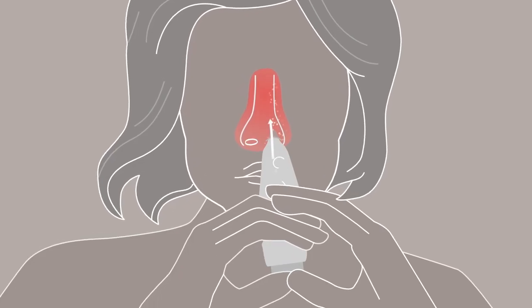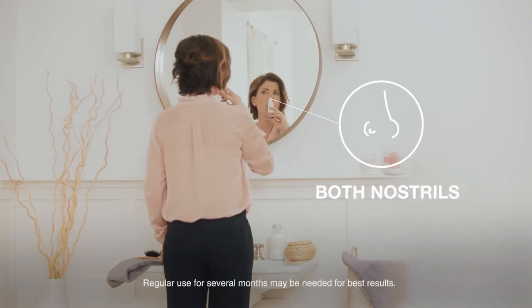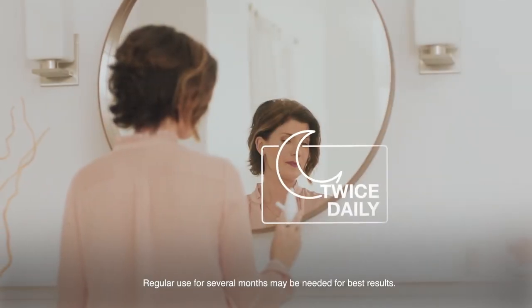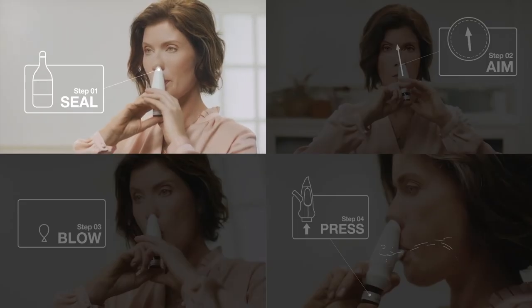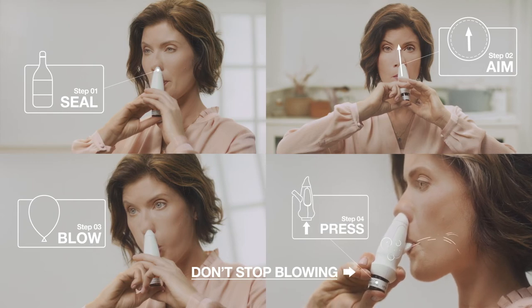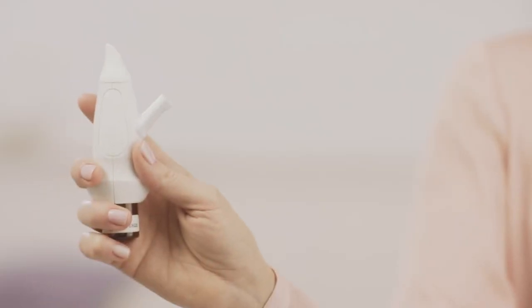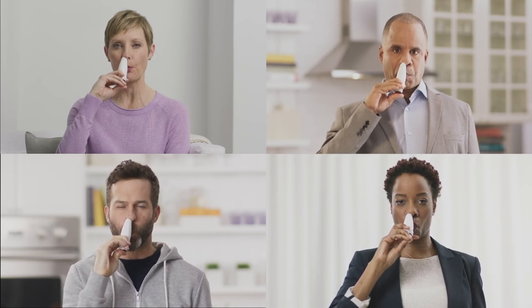If you have a good seal and aim between the eyes, the air should go out the opposite nostril when you blow and press. Now, repeat these steps for your other nostril. Remember to use Exhanse twice daily. Let's bring it all together: seal, aim, blow, press. It's that simple. Want more step-by-step details? Review the full instructions for use. Just like Megan, more and more patients are discovering Exhanse and experiencing a medicine that goes high and deep into the nasal passages. Now, it's your turn.